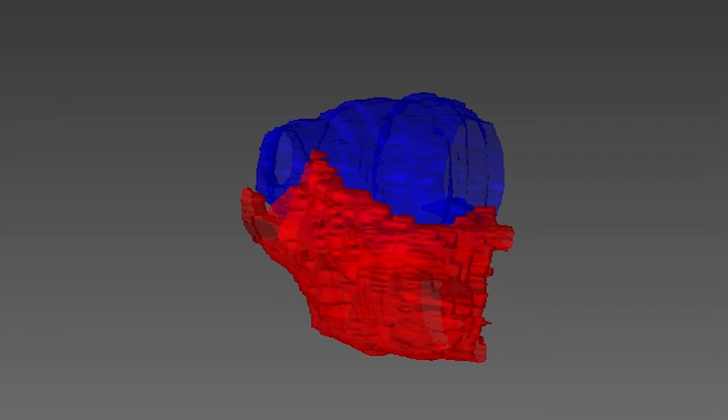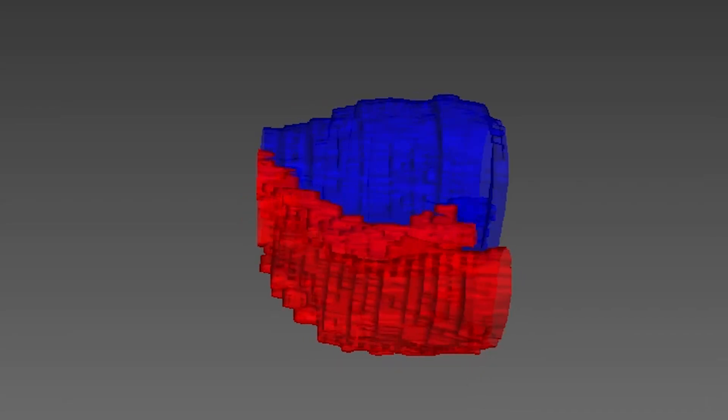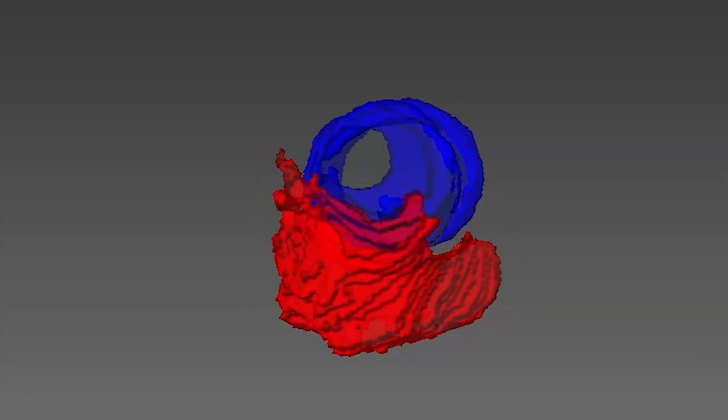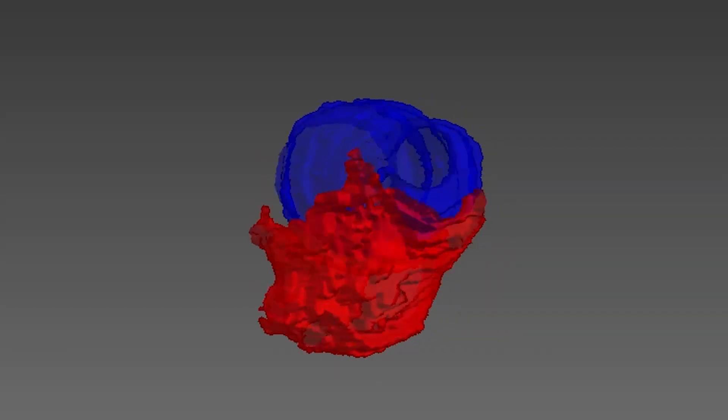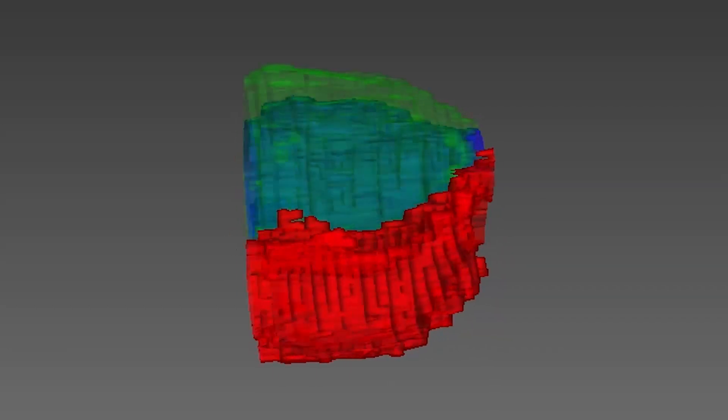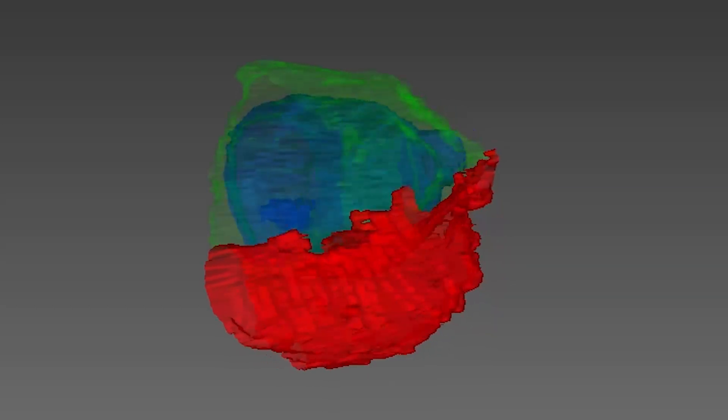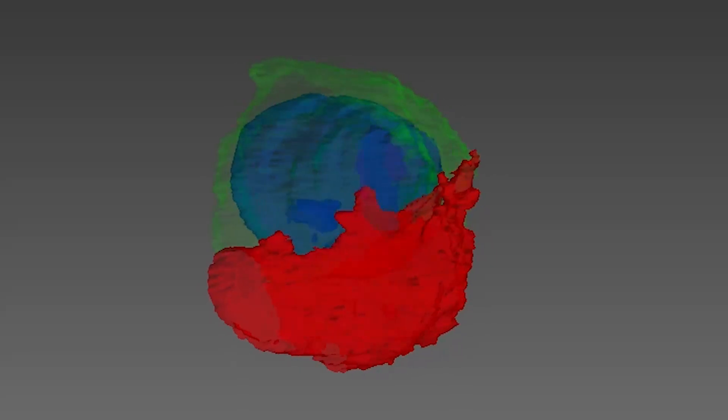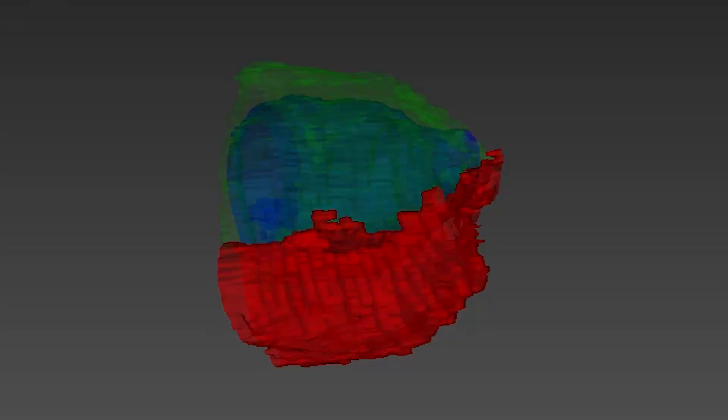Our network performs fully automated segmentation of the right ventricle, the left ventricle, and the myocardium for both the end-diastole and end-systole phases.